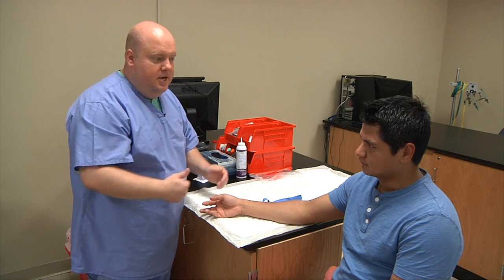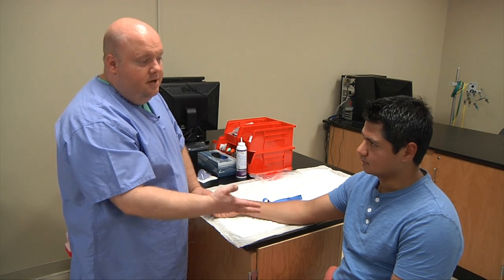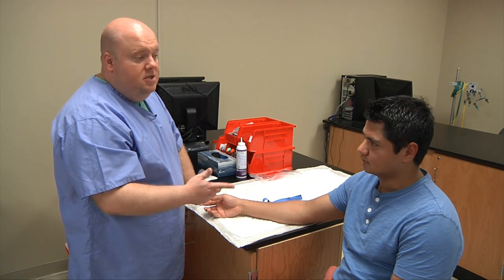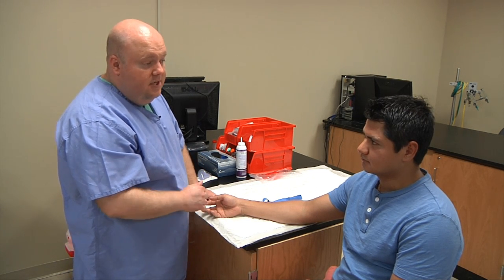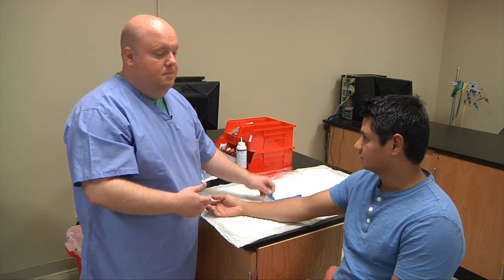Once you've done that, you'll greet your patient and tell them who you are: 'Hi, I'm Trevor, I'm from the lab today. The doctor's ordered some samples from you — do you mind if I go ahead and take a look and see if we can get these samples?' The patient gives consent, so we begin our procedure.